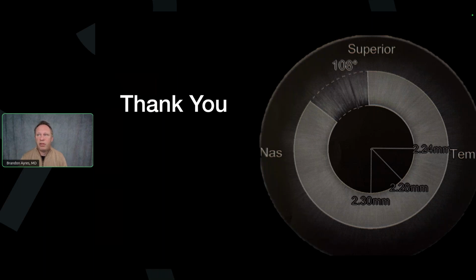We were actually just talking about pupil size, a couple of us, and when someone has large pupils, seeing if we want to go a little bit more peripheral. I suppose you could go thinner if you're worried about overall corneal thickness, but I've never been tempted to go thinner. I've always been tempted to go on the thicker side. It's a great question, and it just hasn't come up yet.